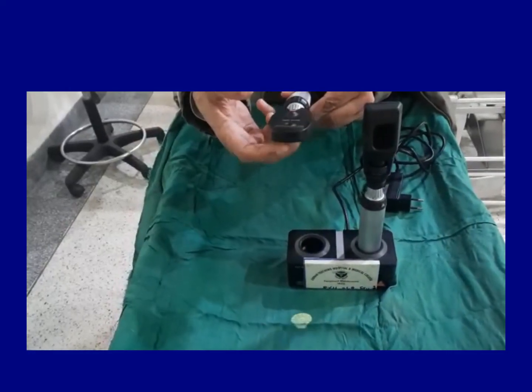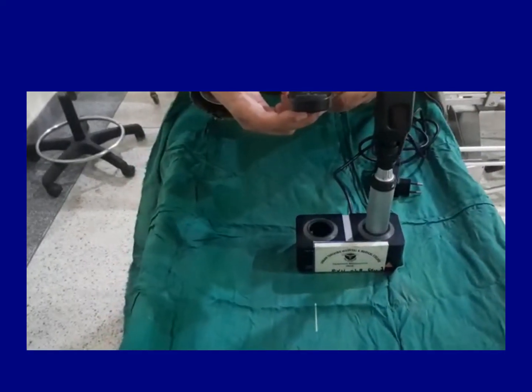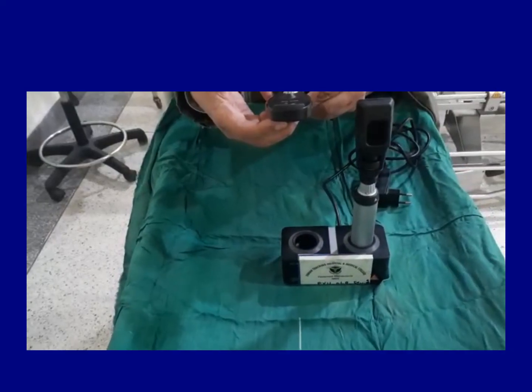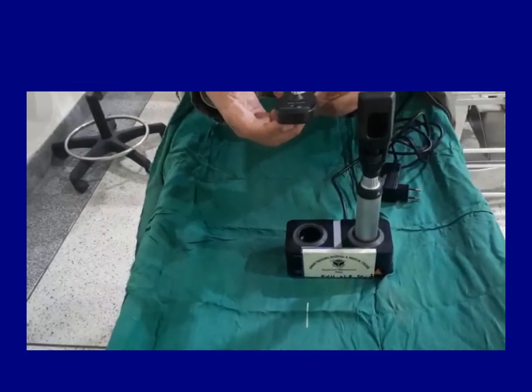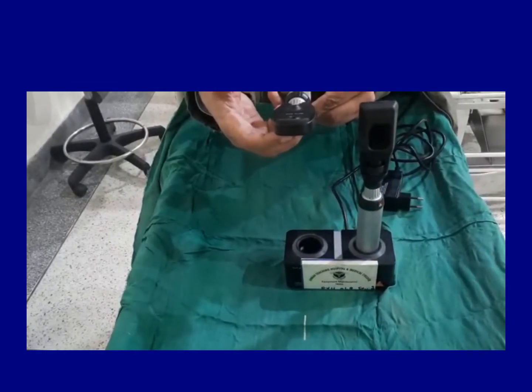Then it has got another thing in it, which is called slit. Slit is used if the lesion is raised in the retina, then the slit will be distorted. Like you can see here, the slit is straight and when I move it on the ridge here, it becomes distorted. So it can show the elevations in the retina.